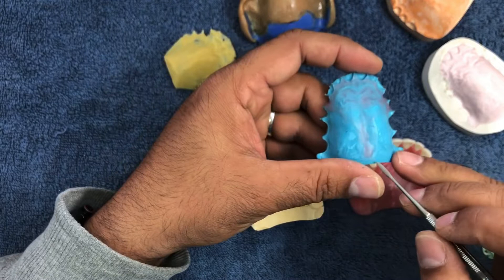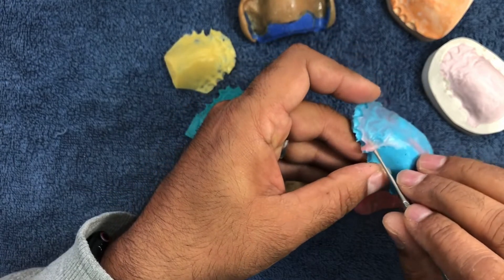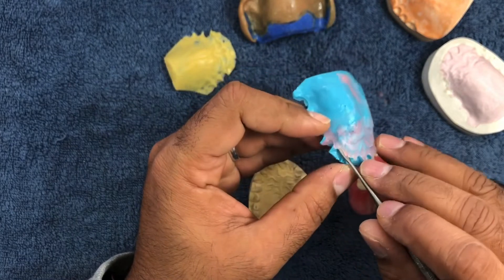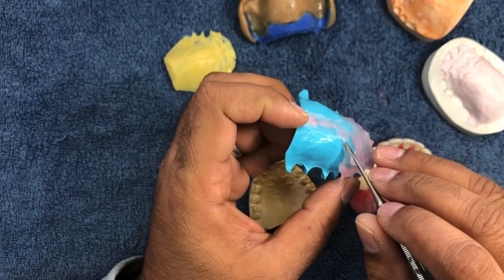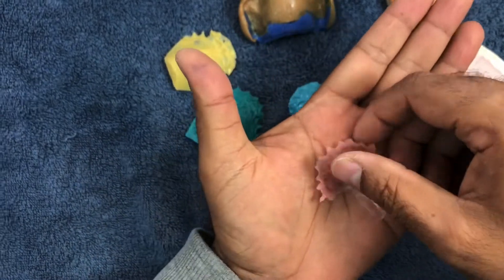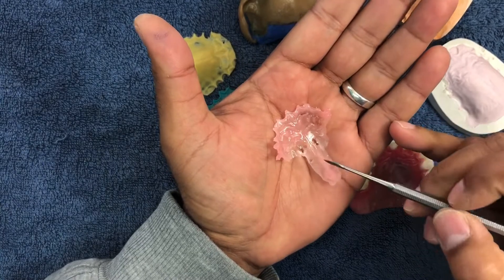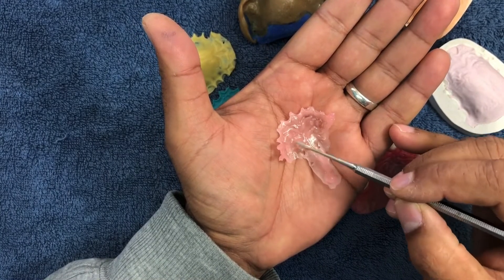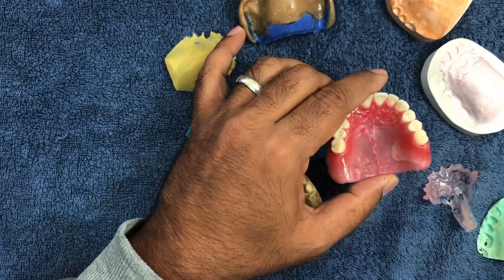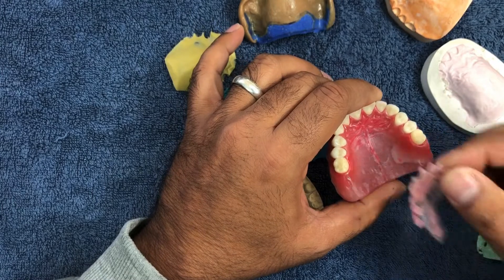Let's see if this is cold enough to peel off. It's peeling off — you've got to be a bit gentle while removing this. Just ease it off the mold gently. There you go. Hopefully the camera will show a clear picture: the incisive papilla, the rugae, and the mid palatine raphae. After this, I clean the palate, remove all the wax, and put one sheet thickness of wax in there, then place this on top.